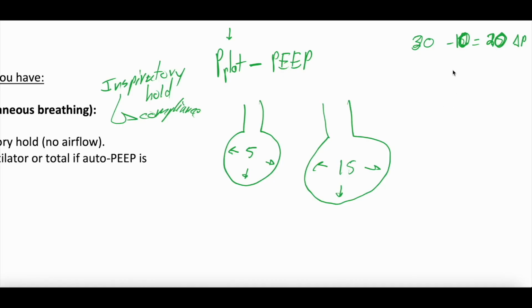And we're going to draw an alveolus if you're watching the YouTube video, and that alveolus is here, okay? And let's say we're like, goodness, is this the right amount of PEEP? Could they be under-distended, under-recruited, or over-distended, over-recruited? And I think, based on my clinical assessment, that they are under-distended, right? I think this alveolus is kind of collapsed down, and they're under-distended.